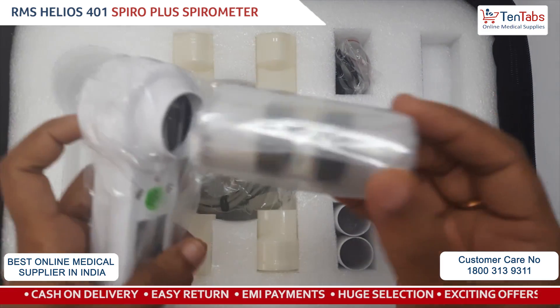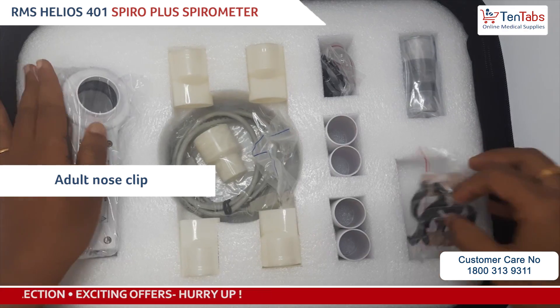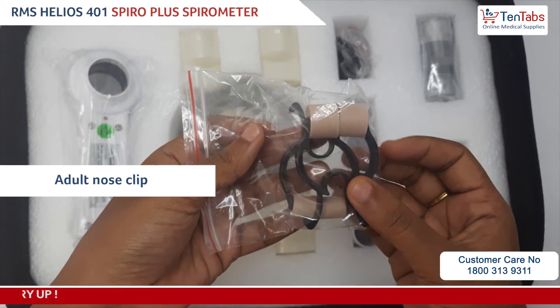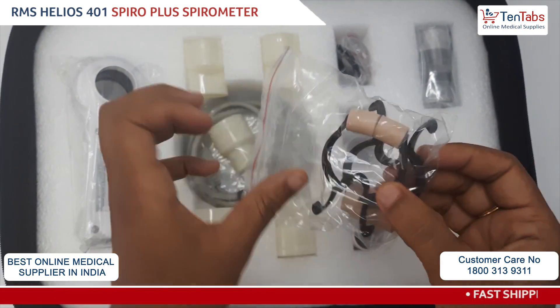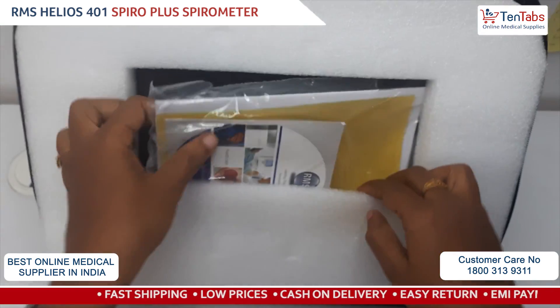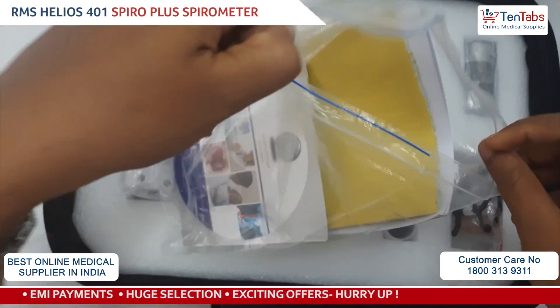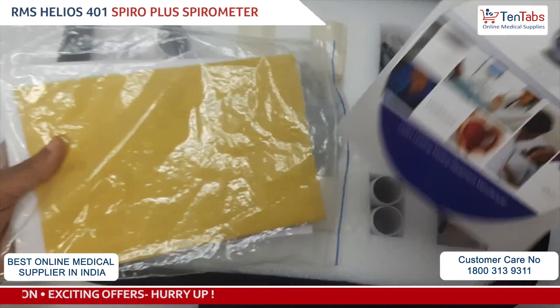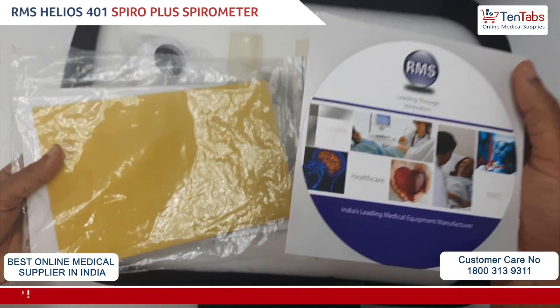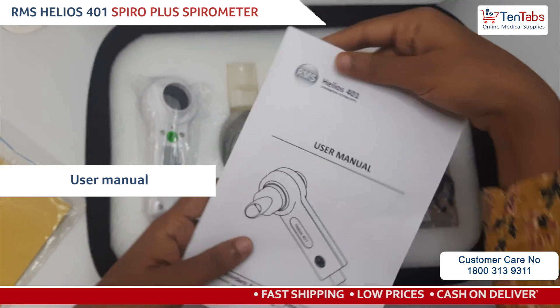These are nose clips — one big and one small. This is the software; there is a CD inside for the software installation. And you have the user manual.